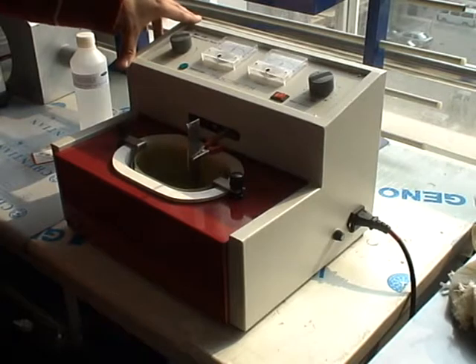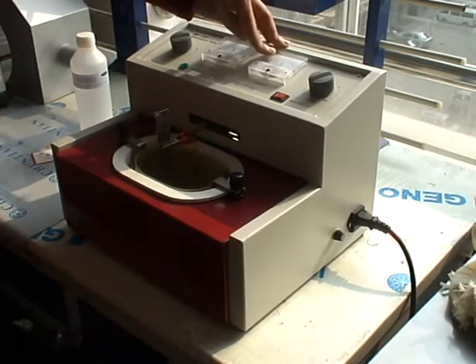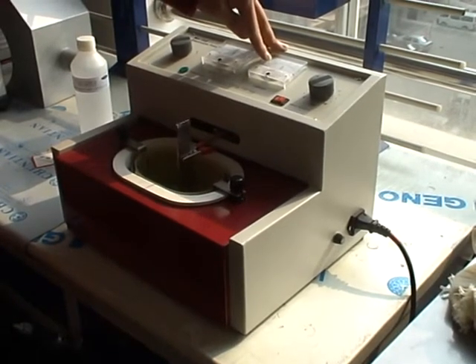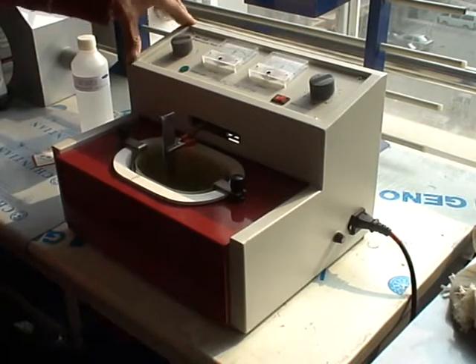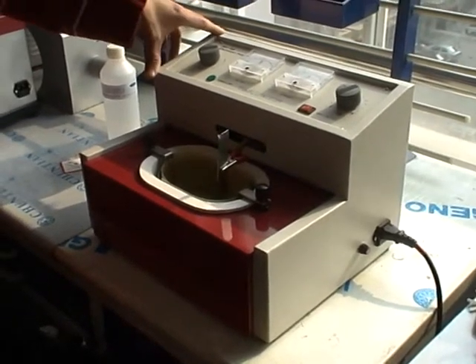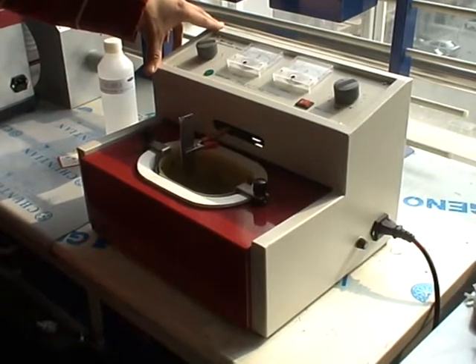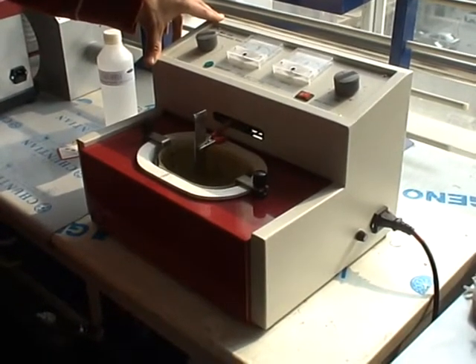Sometimes if the electrical current does not go up and stays at a very low level, this means that the electrolyte is too dirty. You have to replace it with new electrolyte.